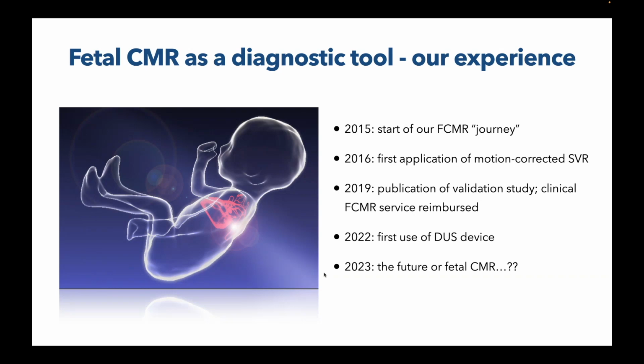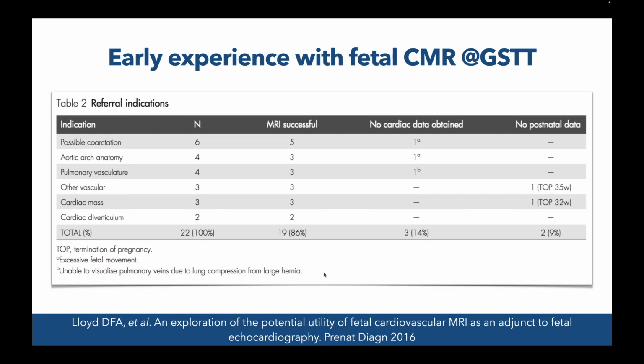Maybe I'll speak a little bit about what could be happening in the future for fetal CMR. So I'll just breeze over these. This was the initial work, and all this really showed was we had an open referral with our fetal cardiology colleagues and said, just send us anything where you think we could give you more information that would be helpful. And from a very early stage, what people were saying is that anything with a vascular component of a congenital heart disease diagnosis was the bit they would really like better quality imaging for, or perhaps more detailed imaging than two-dimensional echo.